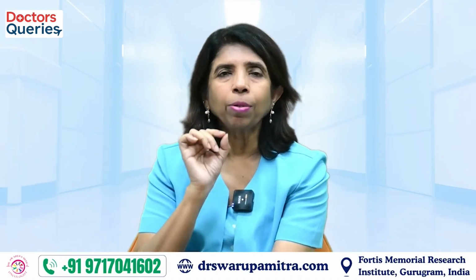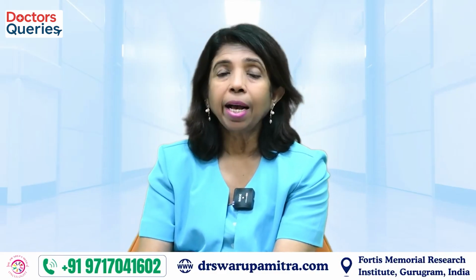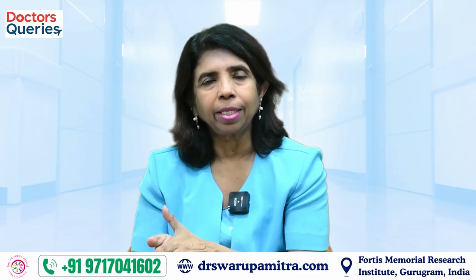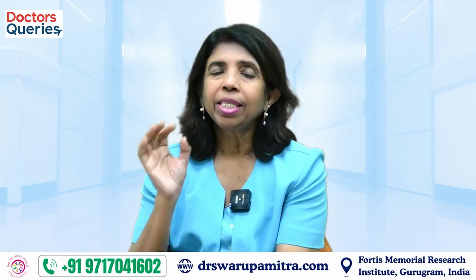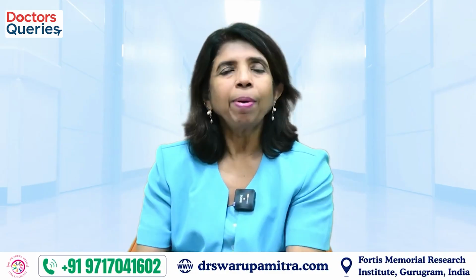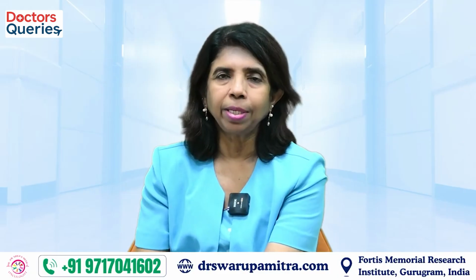Let us talk about the common linear accelerators which we have. When a patient has been planned for radiation therapy, this radiation therapy can be of two intents. One is a radical or curative intent. Second is a palliative intent, which is given for an advanced stage disease. But whatever the intent is, the method of treatment is the same.